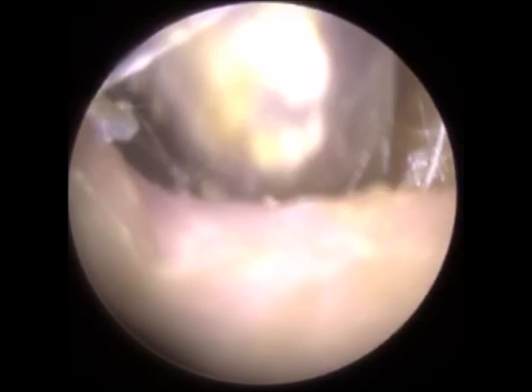It's a tug of war. This plug of skin does not want to come out of the ear. Also with this patient, he's got a very enlarged ear canal, probably three times the size of a normal ear canal, and he's also got a very narrow entrance. So if you do the physics behind it, you're trying to remove a large plug of dead skin through a very narrow aperture, so it's very, very difficult indeed.